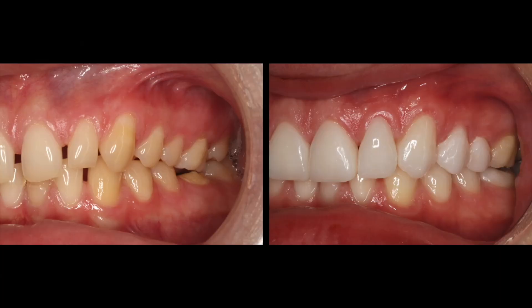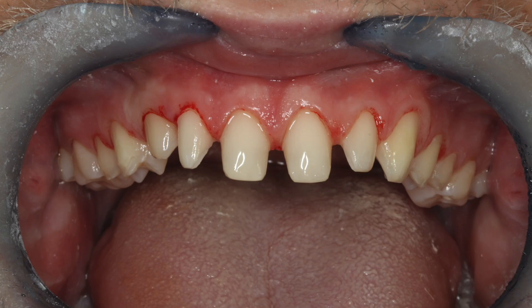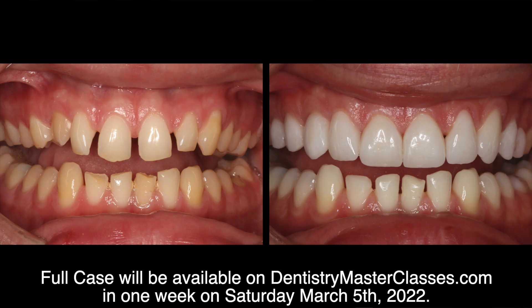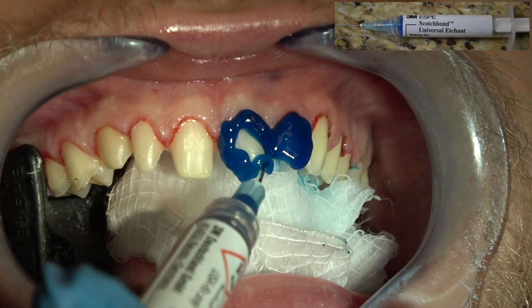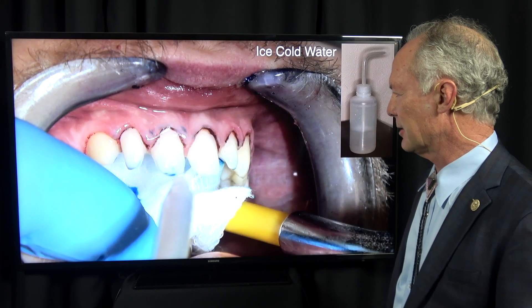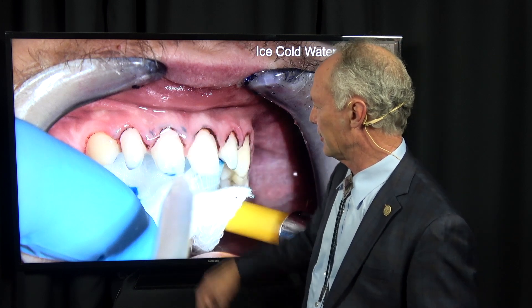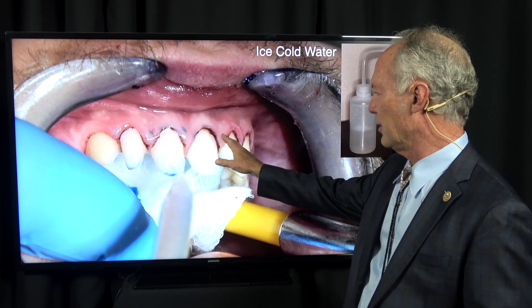There's just befores and afters of this case. Initially I've prepared the maxillary anterior teeth and bicuspids for veneers. The first thing we do with veneers, we etch the teeth, and then we rinse the etch off with ice cold water. What I discovered by accident years ago is that 38% phosphoric acid is a fantastic hemostatic agent. Look at the bleeding around the gums that's scabbed with that 38% phosphoric acid — I'm leaving it on the teeth 45 seconds to a minute and also on the gums.